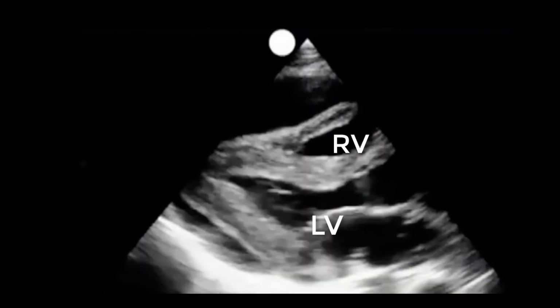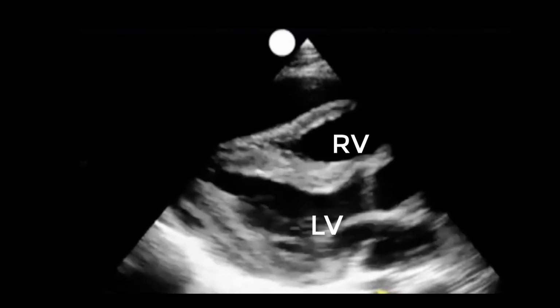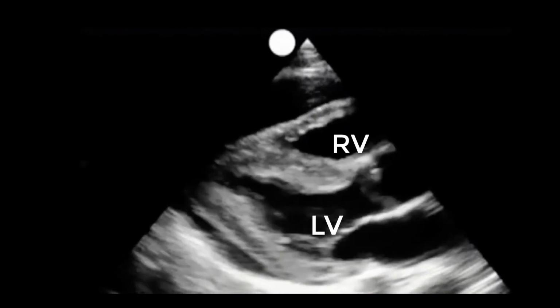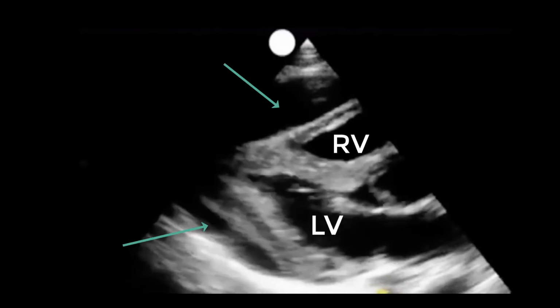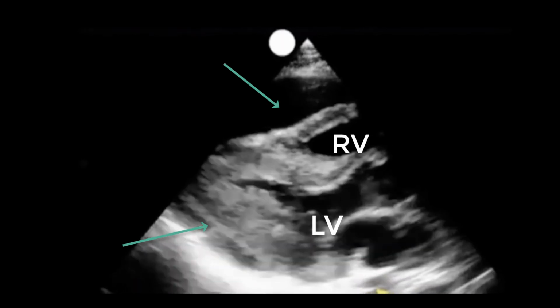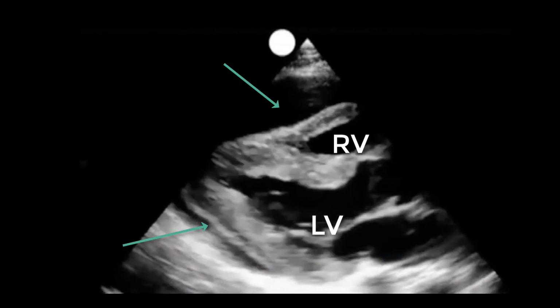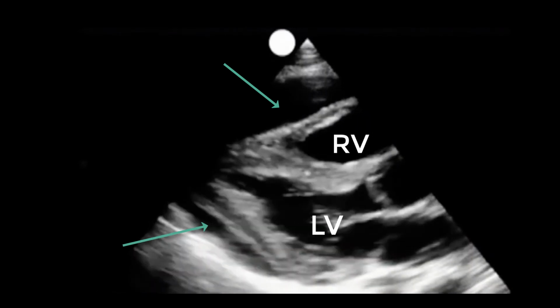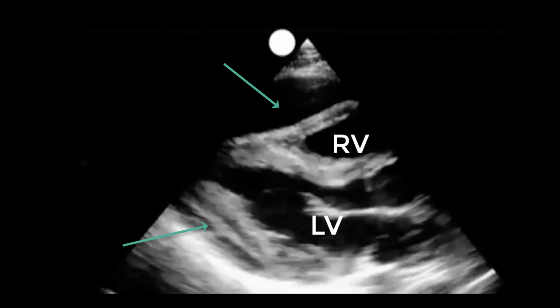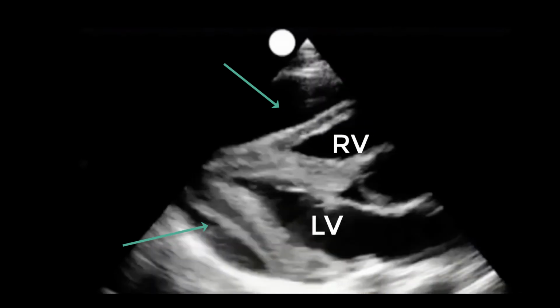Here's one of the pathologic features we are trying to identify in the RUSH exam. This is pericardial tamponade. We can assess for fluid in the pericardial space, which, like most fluid, follows gravity and therefore will accumulate posterior to the LV. We can also look at the right atrium and right ventricle for any signs of collapse during diastole. If this is visualized, then the cause of shock is likely tamponade.